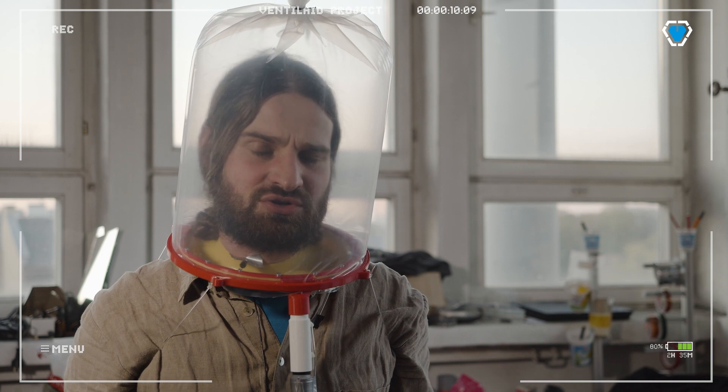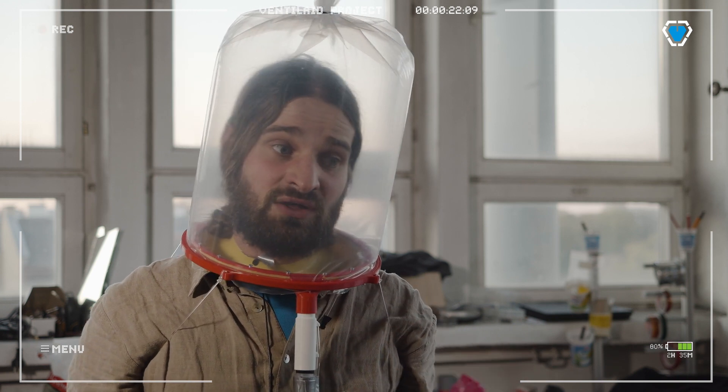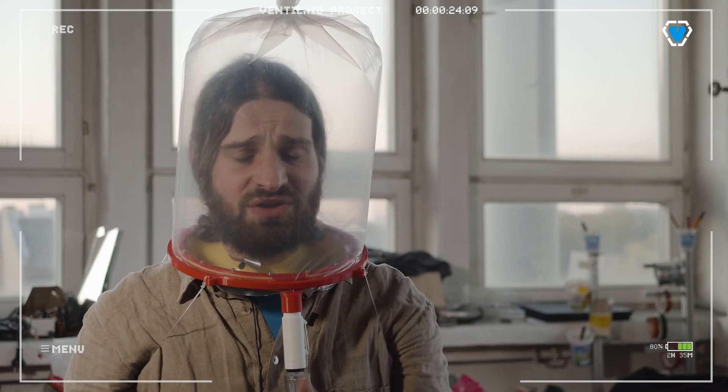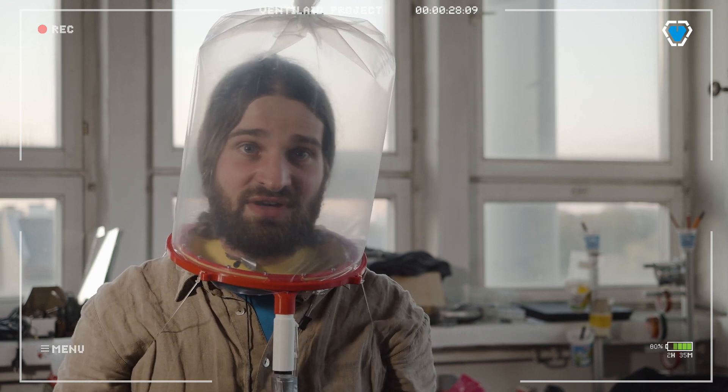Hey guys, I'm not sure if you can recognize me, but this is Szymon from Ventilaid speaking to you again. And no, it's not that on the weekends we make movies of crappy science fiction from the fifties or sixties. It is that we are trying to find a way to provide you with some less invasive, non-invasive ventilation.